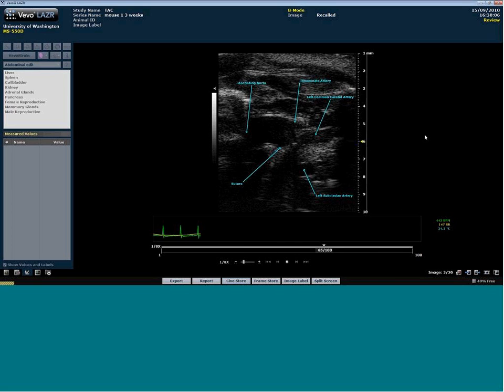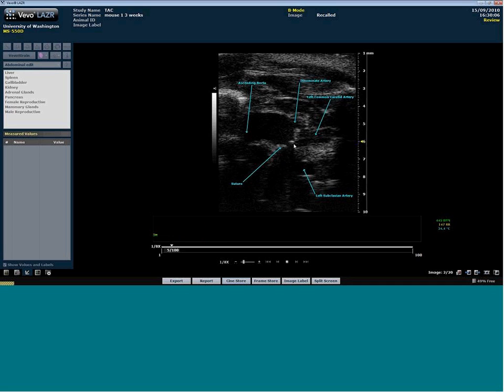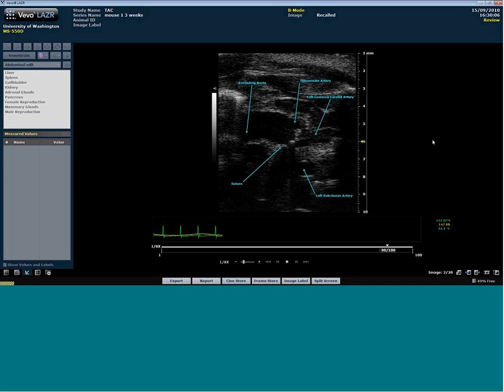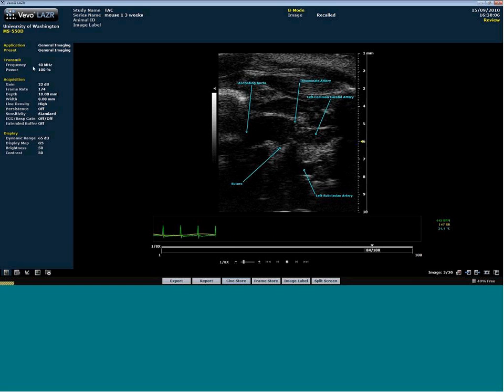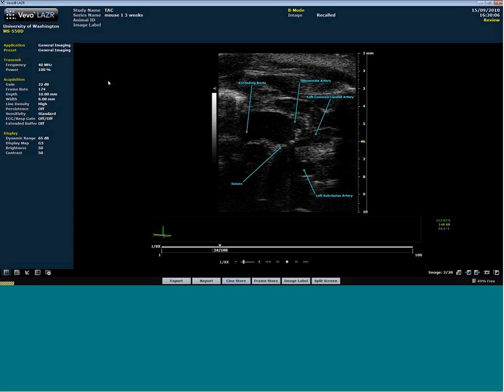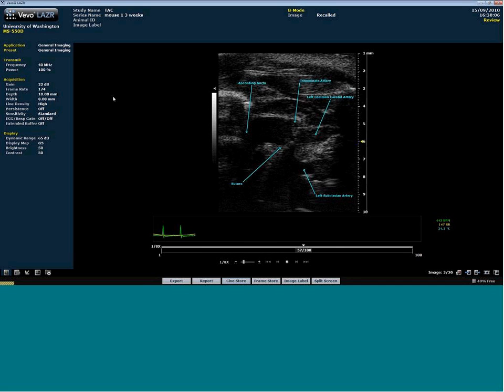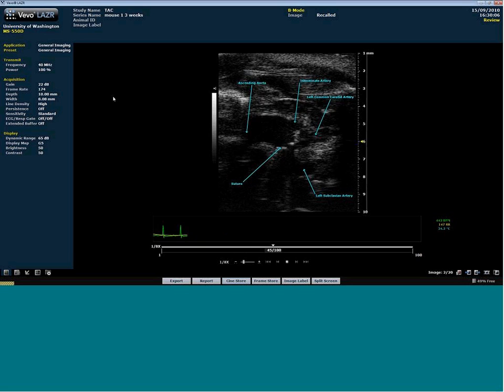Sure. So I've just got a nice B-mode image here of a TAC model that I pulled up, so you can see in the aortic arch, you can actually see where the suture is right here, and how the ascending aorta is ballooned out right here. This is actually done with the 550D with the 40 megahertz probe. So as Andrew alluded to, there's a lot of relationships between various aspects of transducers.